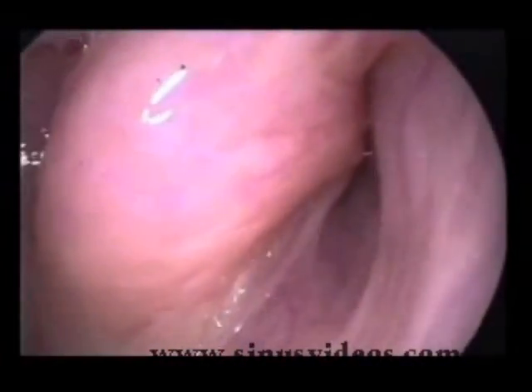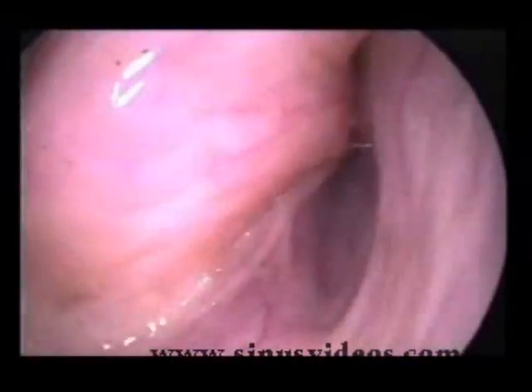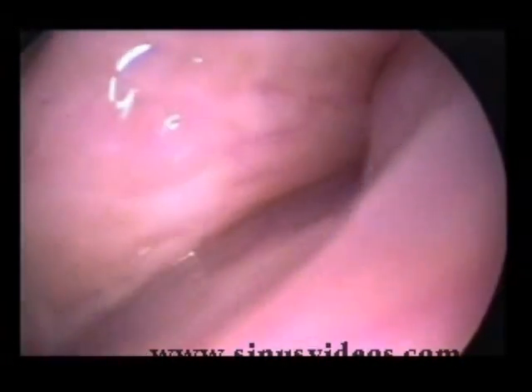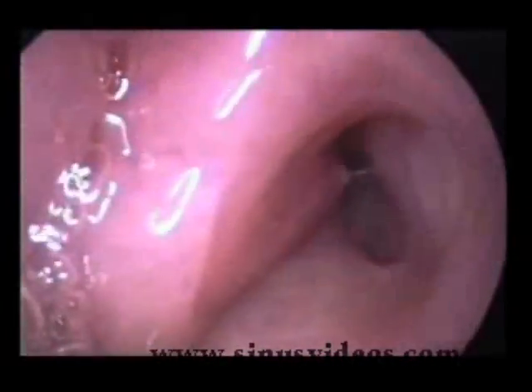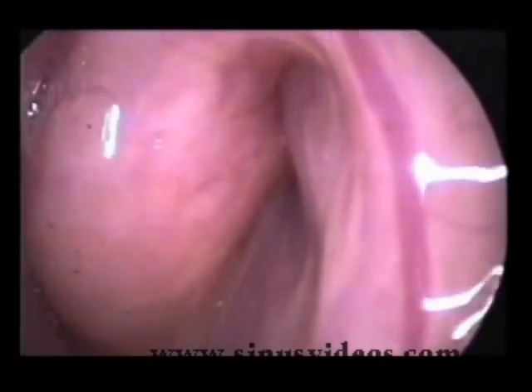The subject is saying KKK to elevate the soft palate and levator, and then performing some swallows. Next we see a yawn for maximal dilation of the tube at its valve area close to the isthmus.